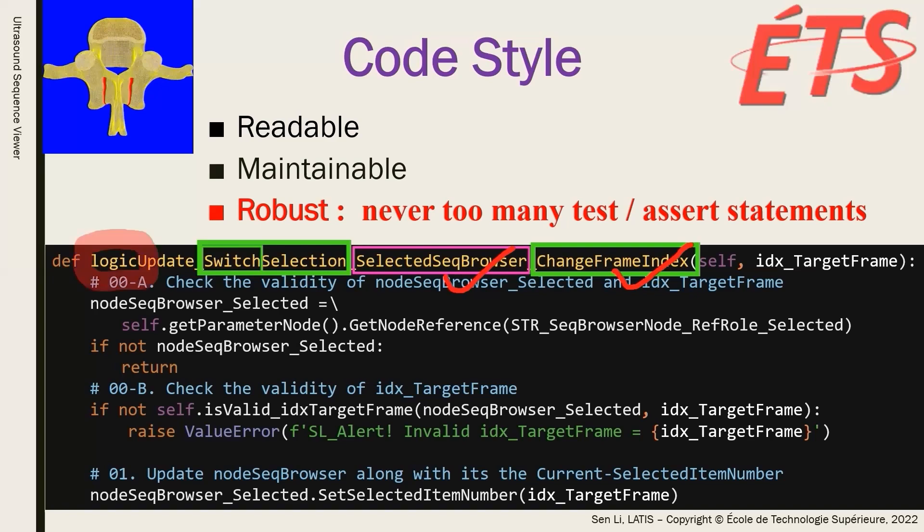To make the selection switch work outside our module, this function only updates the back-end data without any change in the user interface. To achieve the objective of this function, we simply need one statement. To set the selected item number of the active sequence browser nodes. But you can see that this function checked the validity of both sequence browser nodes and the index to update, just to make this function robust.